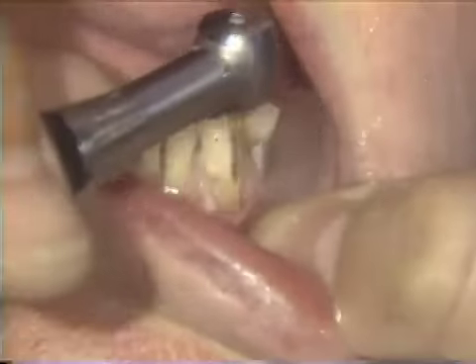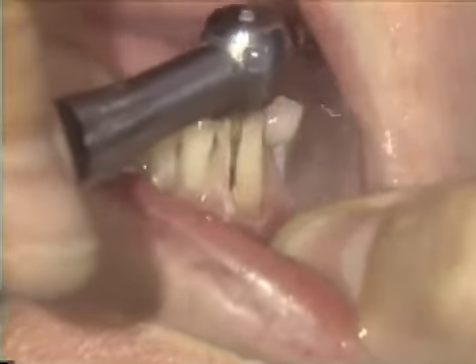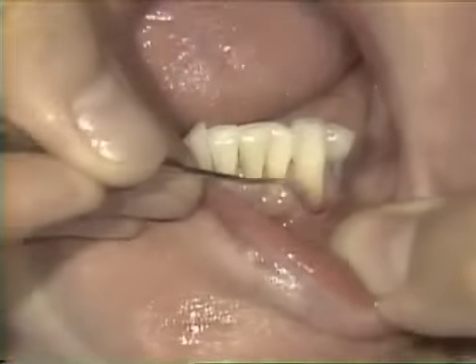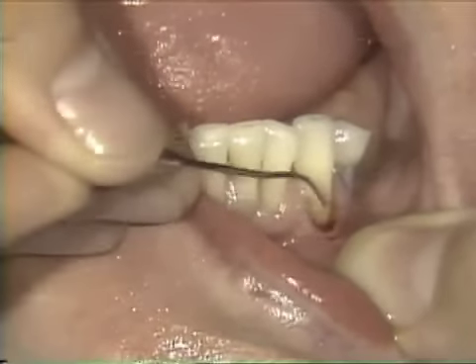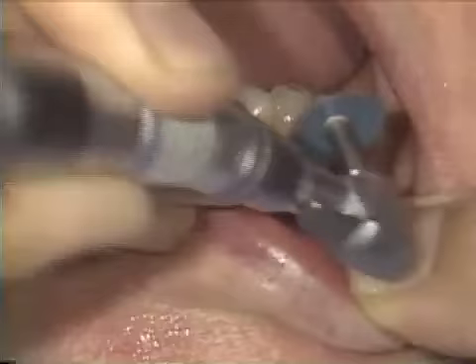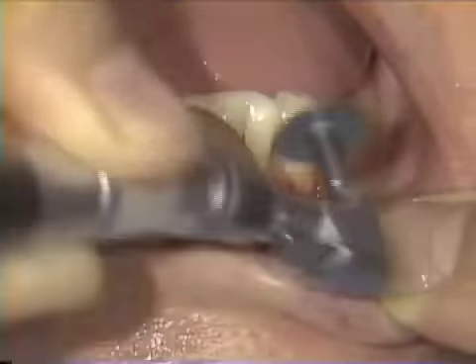A 7901 finishing burr is used to remove excess composite and to contour. The margins are evaluated with an explorer. A series of finishing discs and polishing paste are used to finish the restoration.